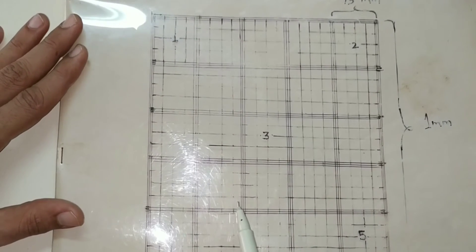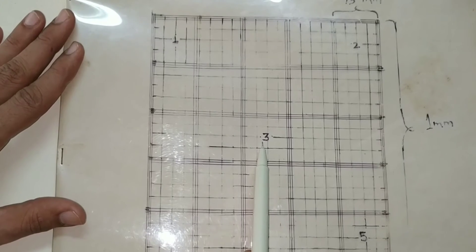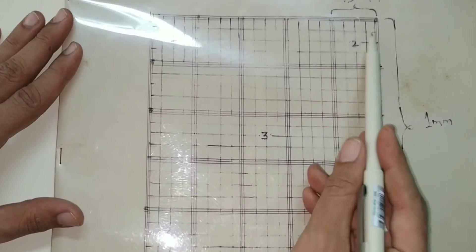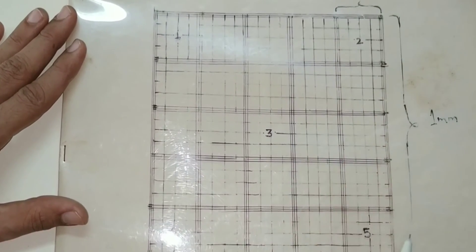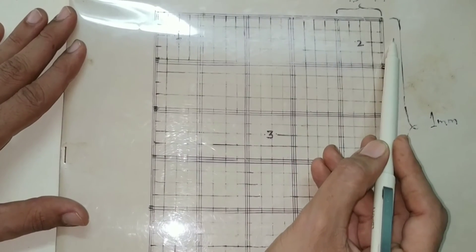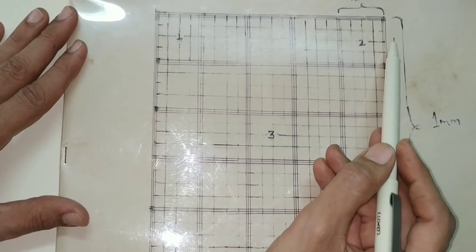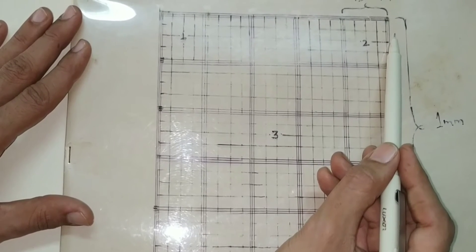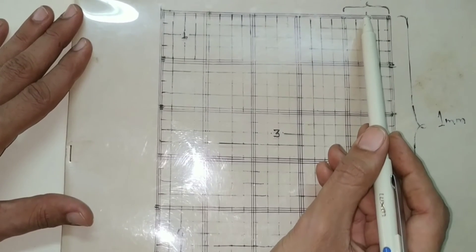For total RBC count, we use 4 corner squares and 1 central square. The volume of each medium-sized square: since the central square is 1 mm and divided into 5 parts each side, each medium square is 1/5 mm × 1/5 mm, and the depth is 0.1 mm (1/10 mm). Therefore, volume = 1/5 × 1/5 × 1/10 = 1/250 cubic millimeter.